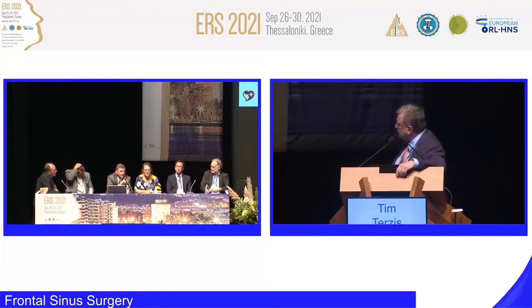future, if there will be an indication, then I will do a complete ethmoidectomy, removal of this agger nasi cell, of the suprabullar frontal cell, so a type 2A or B. I think A is enough in this case, but it depends on the anatomy, with the curved curette to remove these cells, if we decide to do it, but no surgery in the beginning.